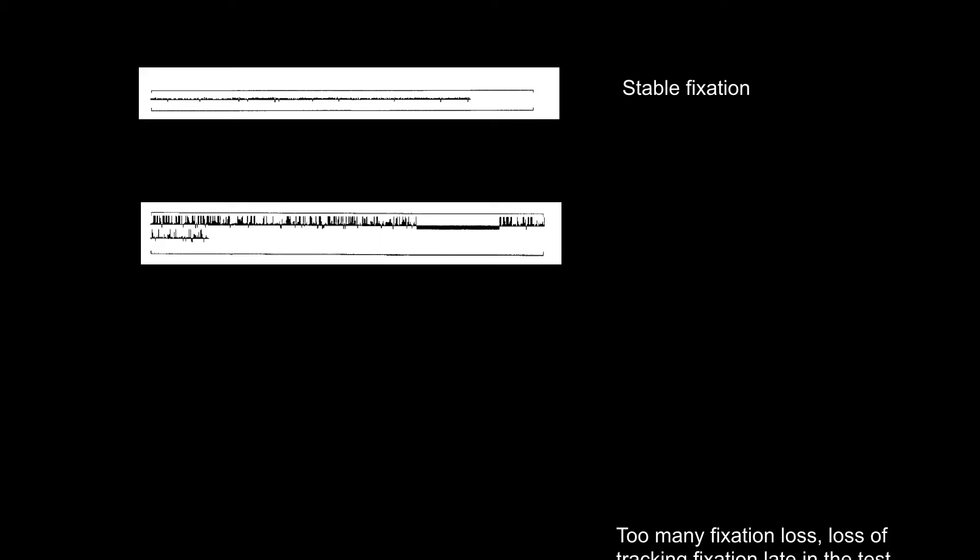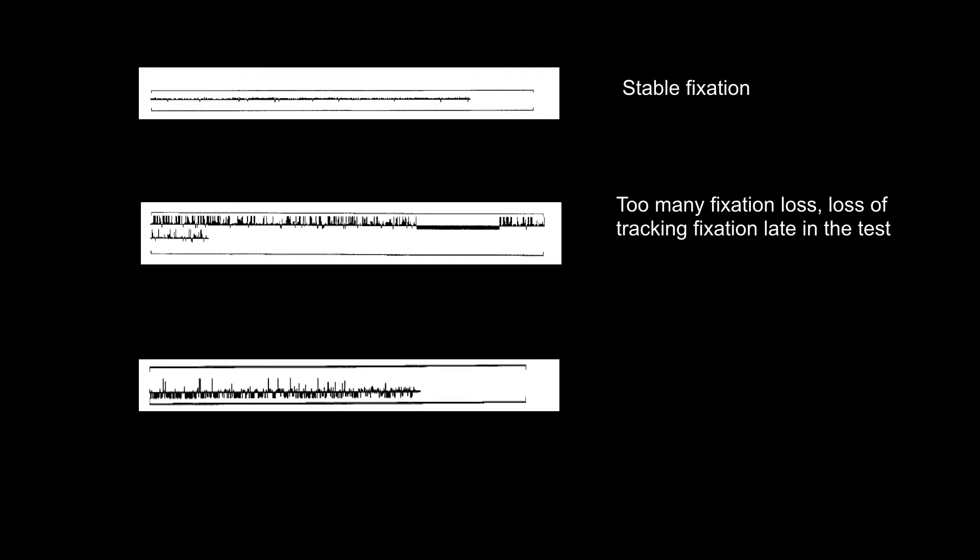These are examples of the gaze graphs. Stable fixation in the first one. The second one, the patient had too many fixation losses and had a period of losing the tracking fixation because the patient fell asleep.